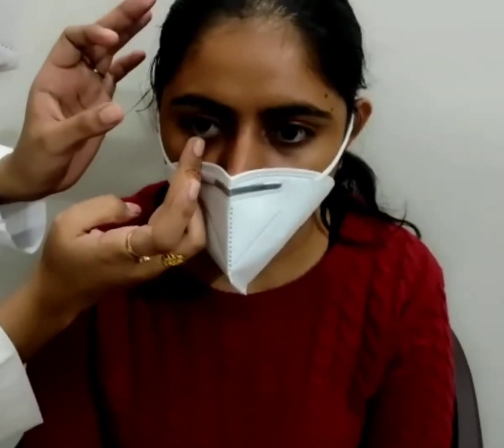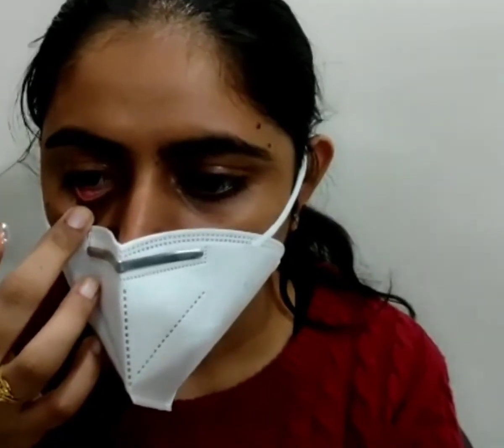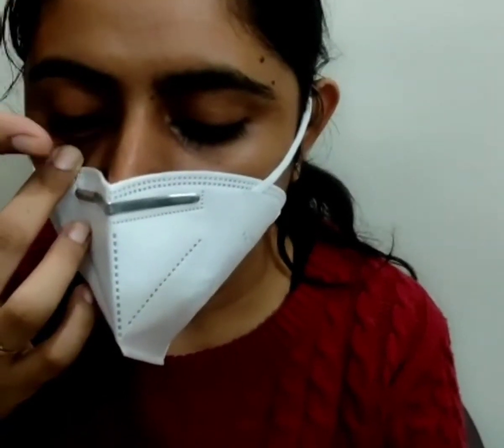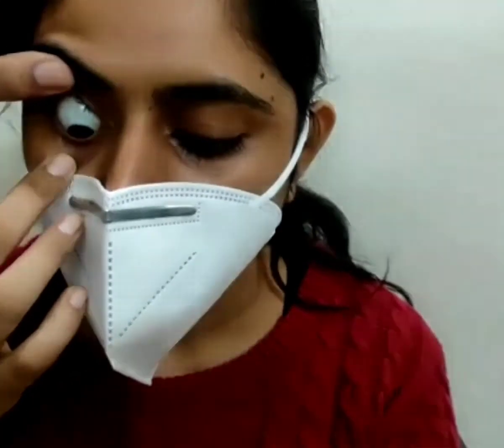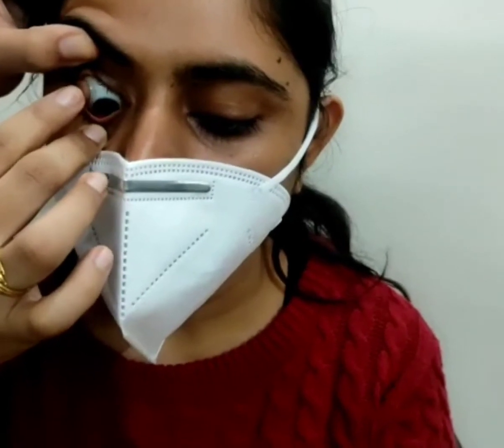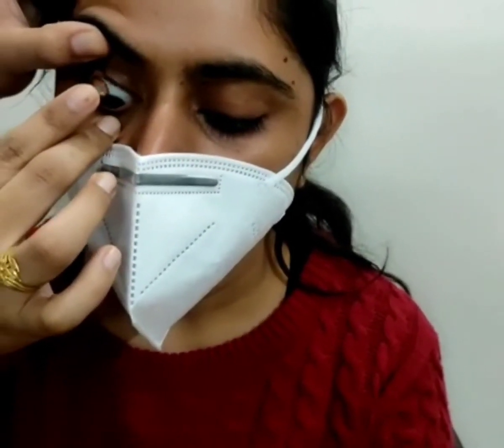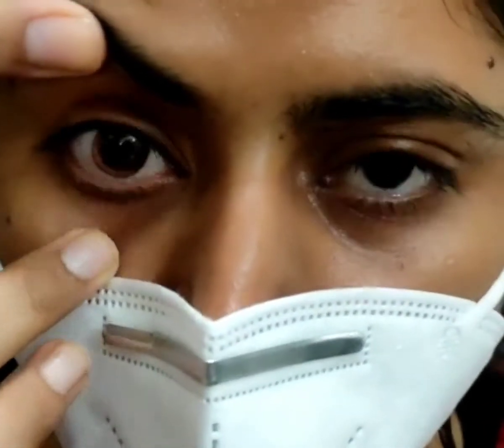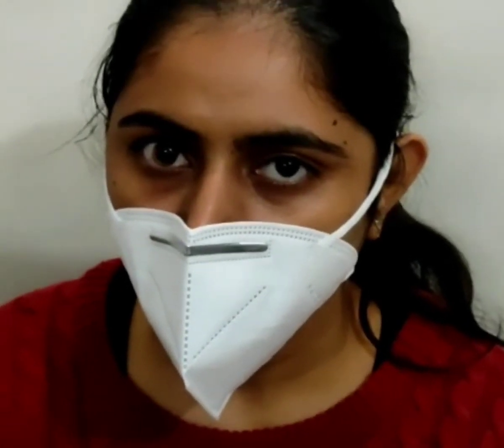Pull the lower lid margin down with the middle finger of the hand holding the lens. Now instruct the patient to look down. Lift the upper lid with the thumb of the other hand while resting this hand on the patient's forehead. Gently place the lens. Now ask the patient to look straight ahead again. Because of capillary attraction, the lens should adhere to the ocular surface. Now give the patient some time to adapt to the lens.